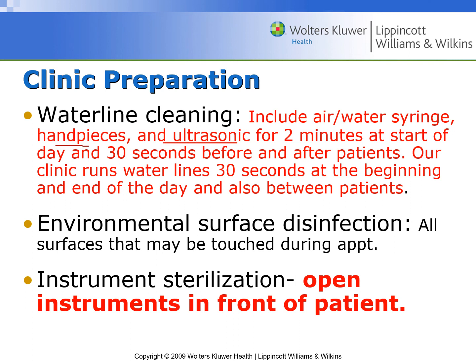Environmental surface disinfection: all surfaces that may be touched during the appointment need to be cleaned off. And instrument sterilization, once again, open in front of the patient. Can't stress this enough. So many things that I want to really soak into your brain. I'll put them multiple times through the PowerPoint because you're getting a lot of information.